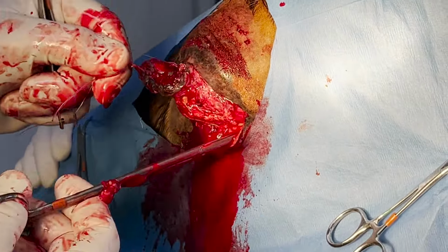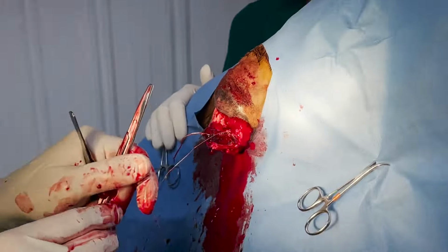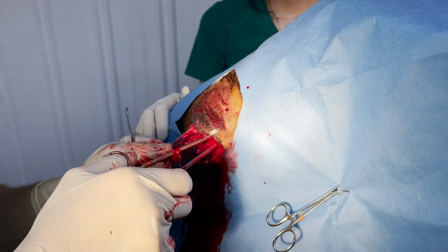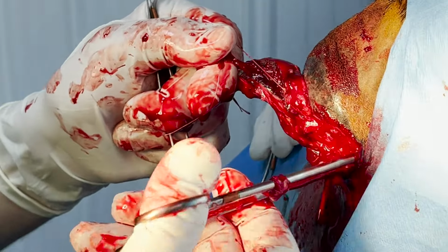Will you grab one of the big biopsy containers? They're in the lab right beside the incubator. Now we're just about back there, and what I'm going to do is feel and make sure there's nothing else hanging on, and if there is, we'll address that and cut it, and then get back to that nerve and cut it. The optic nerve is like the size of my pinky, and we've got to cut through it.